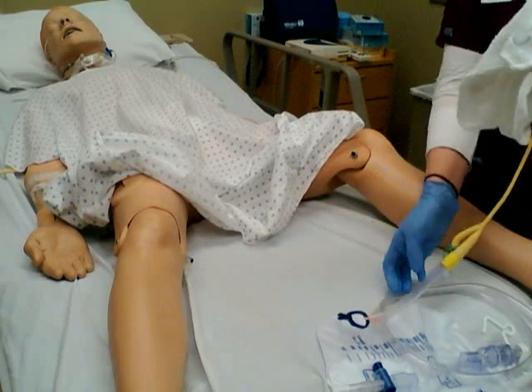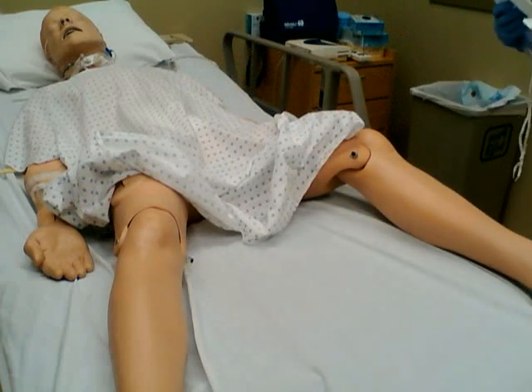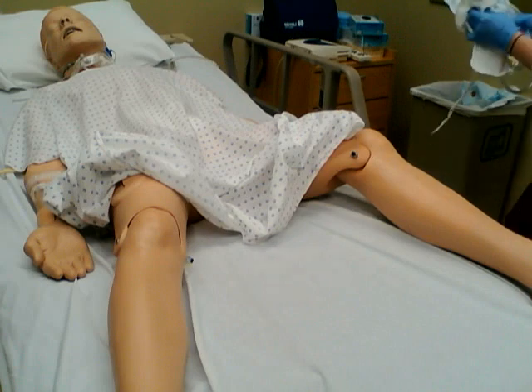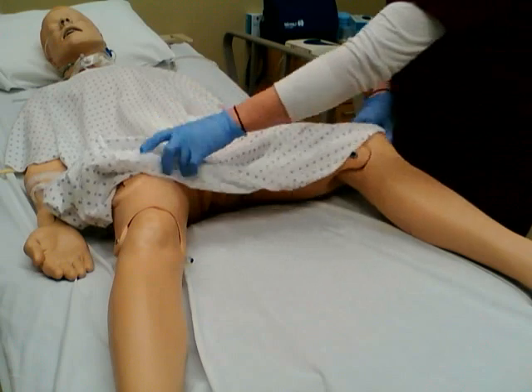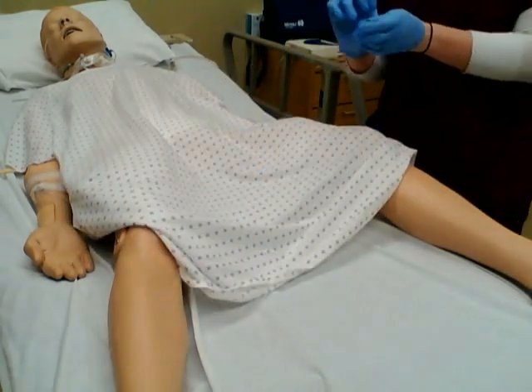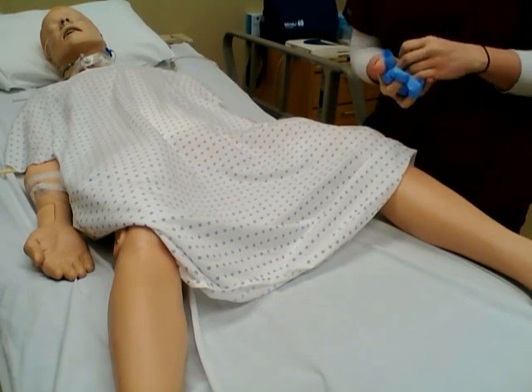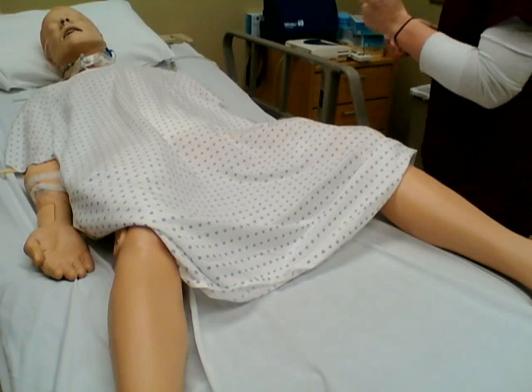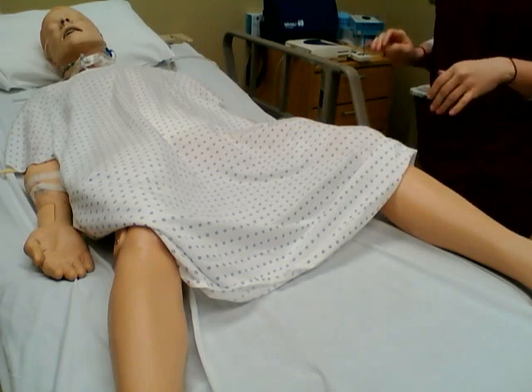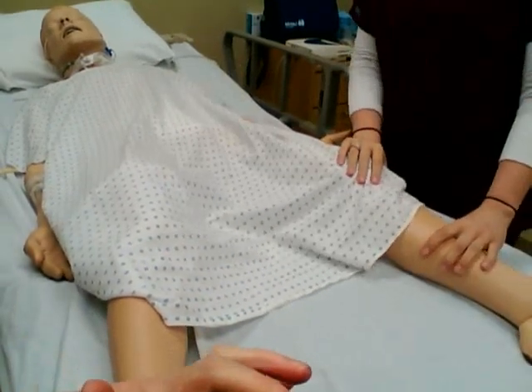And then you want to check the end of the catheter to make sure that it's all intact and that nothing got left inside the patient. That could be extremely dangerous. You want to cover our patient and dispose of everything properly. Then you want to go to the nurse's station and finish all your last charting, your last I&Os from right before you removed the catheter, what was left in the bag, checking to make sure the patient is okay, and then you're all set to go.